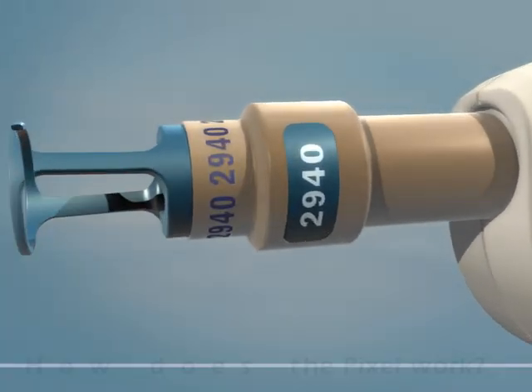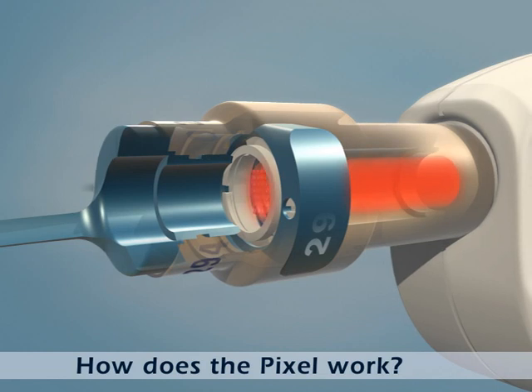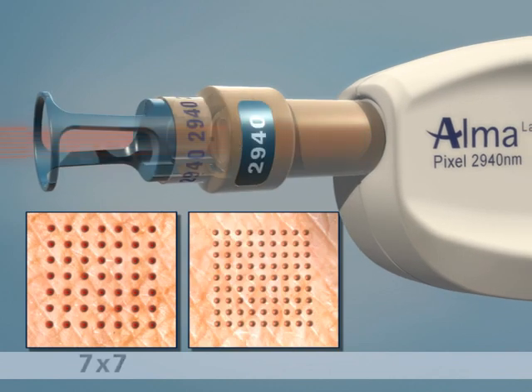Let's take a look at how the Pixel works. The Pixel laser beam passes through unique optics that divide it into multiple beams, arranged in either a 7x7 or 9x9 pattern.